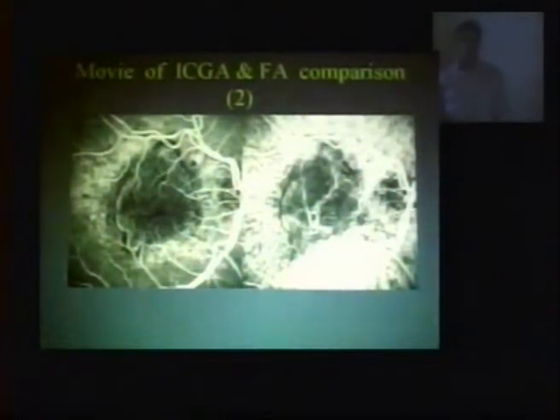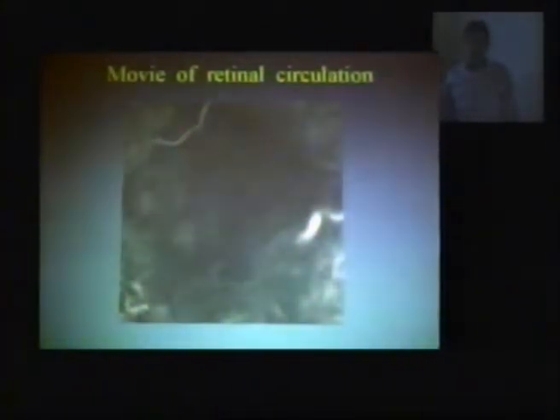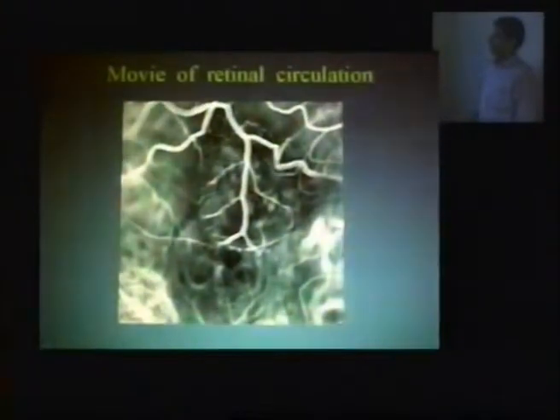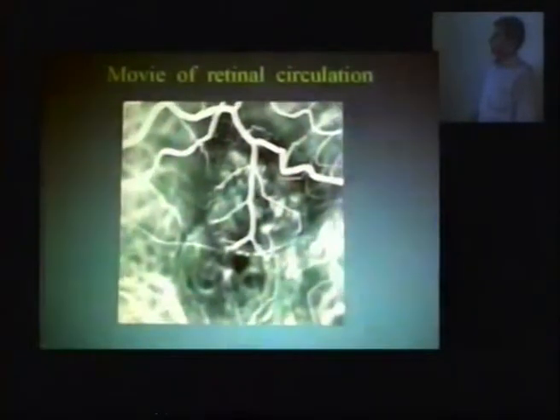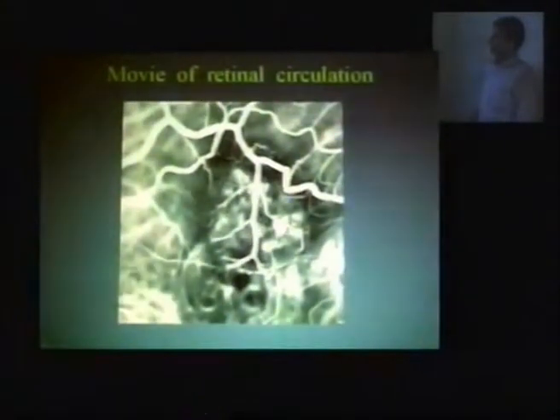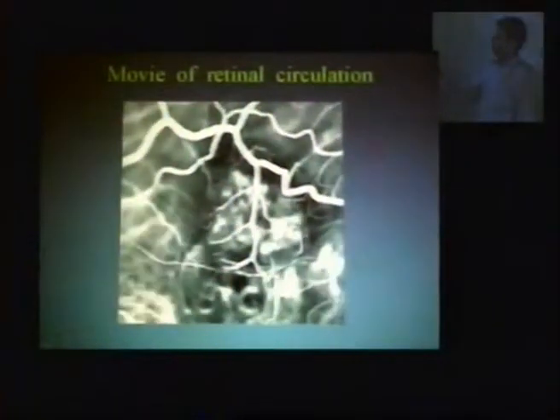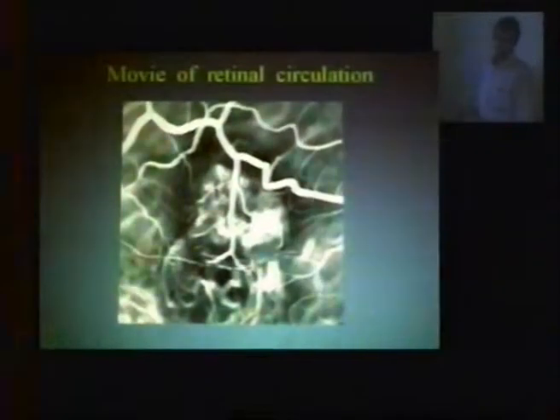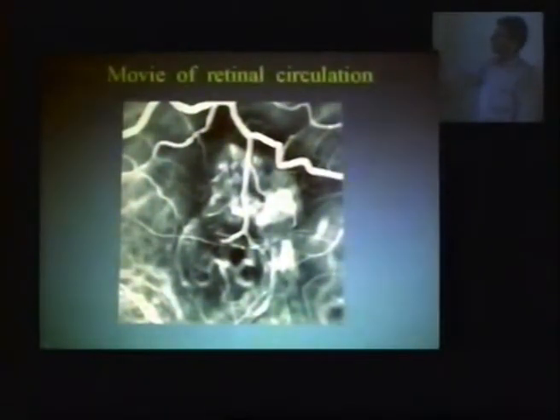Now, sometimes we mistake, like I said before, retina vessels for choroid vessels, and I'll show an example. Okay, look carefully at this, and we can look at it again, see, okay, well, is that a feeder vessel? Is that a feeder vessel? This whole thing is elevated. It is actually in the retina. It's the hemangioma. Okay? So we should not make the mistake of thinking that as a feeder vessel. This is a retina vessel feeding with the hemangioma, not a choroidal structure at all.